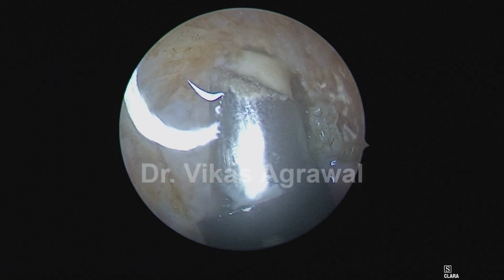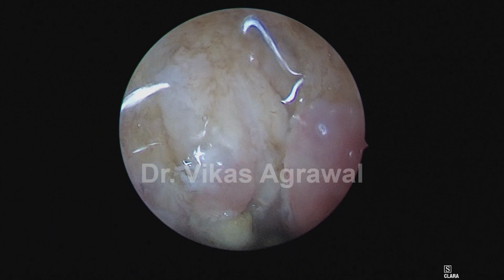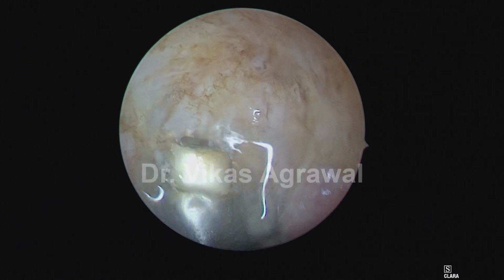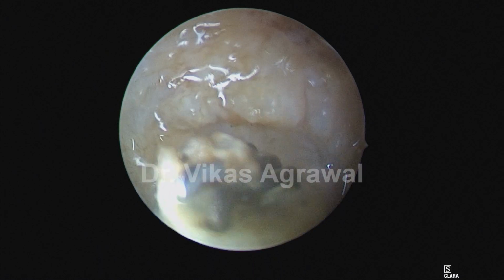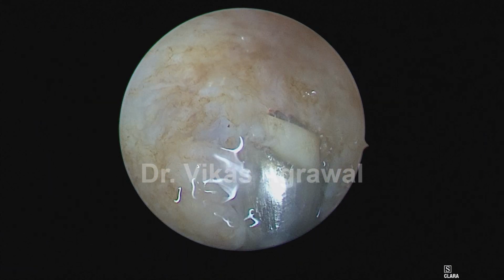We will remove all the tissues layer by layer from the fossa of Rosenmuller, and also simultaneously remove tissues from the posterior boundary. That's the buccopharyngeal fascia. You can very clearly see. That is the fossa of Rosenmuller being cleared.